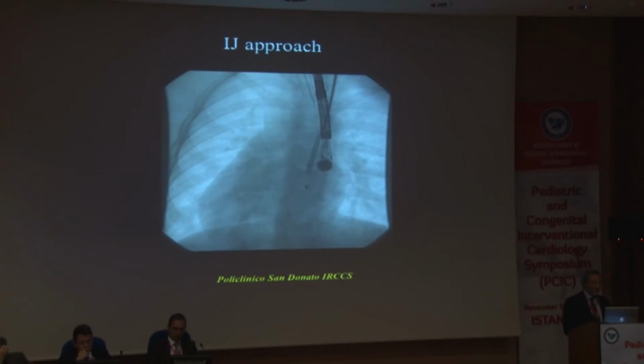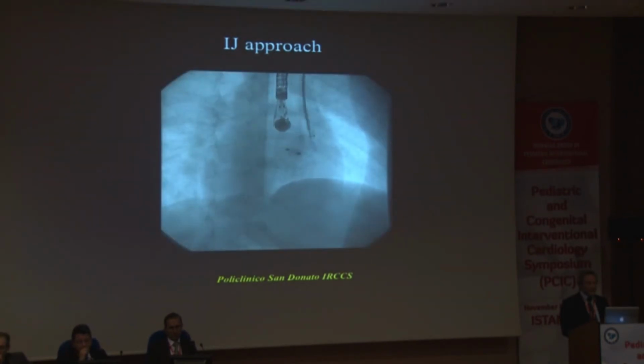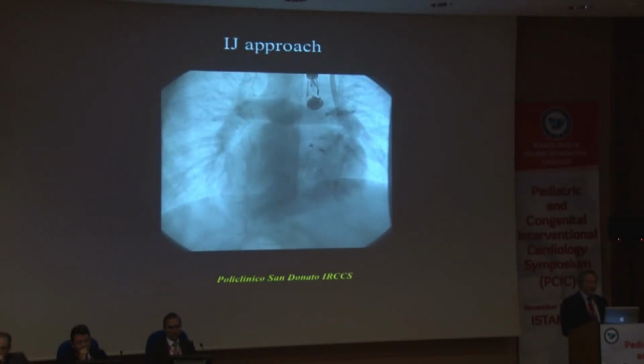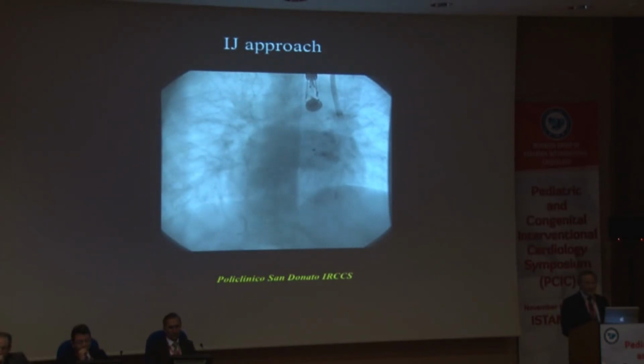left atrium through the right atrium, because this tortuous course to the azygos vein is going to be impossible. So in this particular case, the solution was to get the access to the left atrium through the jugular vein. It was actually rather easy to get into the defect, deploy the device in the mirror image heart, the test angiogram here, and that was an unusual situation we can come across. Well, when you have an azygos continuation or to some extent difficult access to the ordinary route, you can consider the transhepatic approach as well.